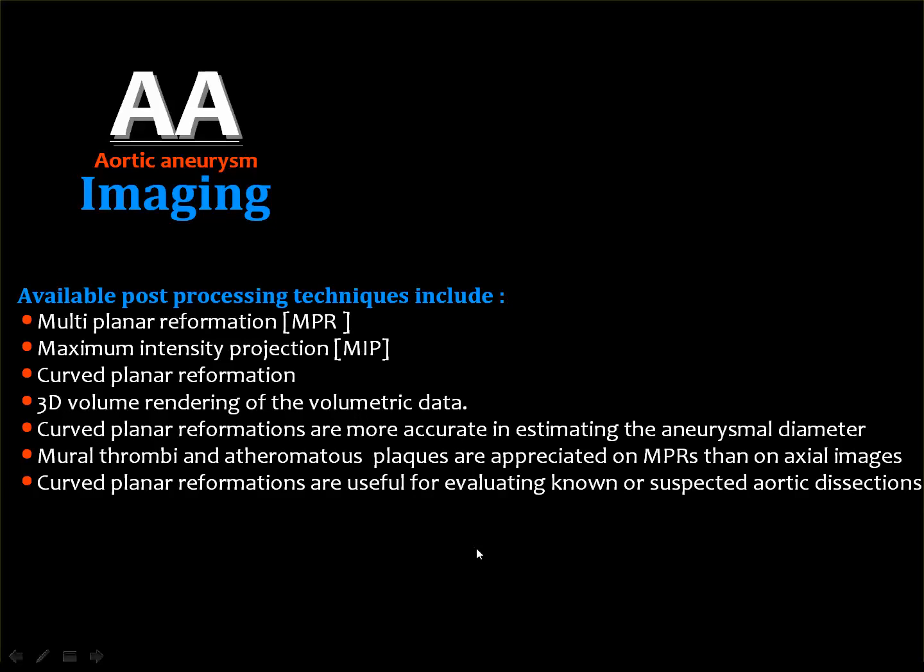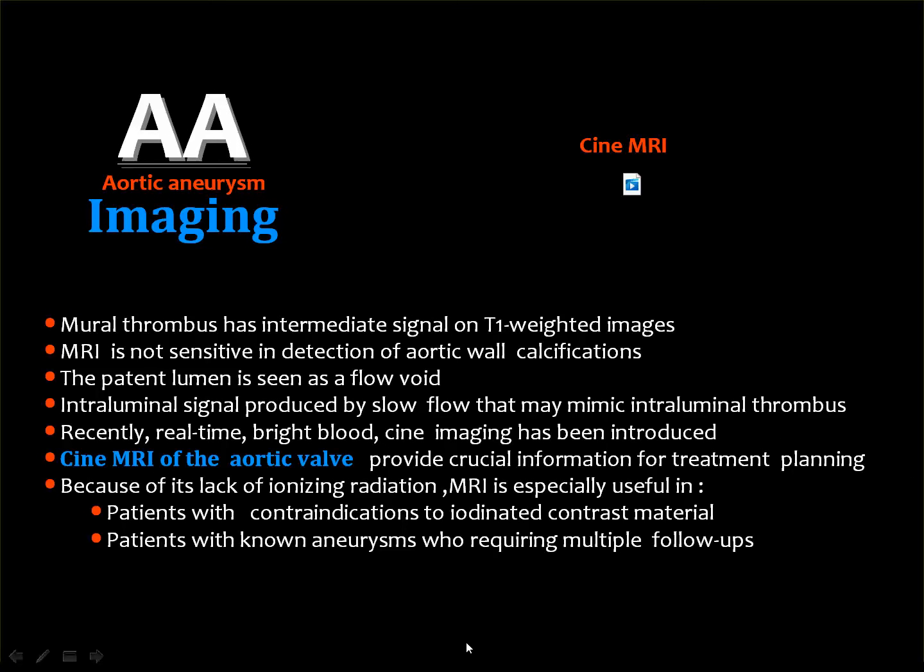All the technicians are well acquainted with these techniques, including the multiplanar reformation, the maximum intensity projection, the curved planar reformation, and the 3D volume rendering, and so on. Then MRI is an important diagnostic tool, but the examination time is relatively longer than that of CT. MRI does not use ionizing radiation.